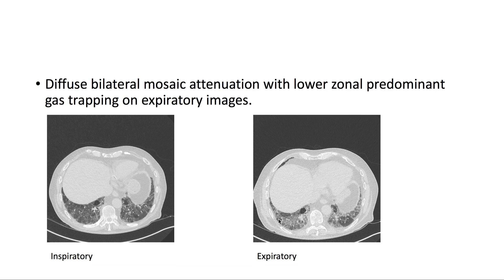Going back to our patient, we note that there's diffuse bilateral mosaic attenuation, and there's lower zonal predominant gas trapping on expiratory images. Here on inspiration, we note this area of hypoattenuation containing air, and on expiration, we note that this same area remains hypoattenuated, confirming that there is gas trapping.